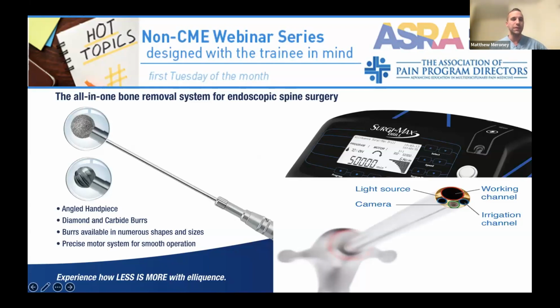So just kind of basically, if you look here to the left, there are multiple types of drills, which you don't generally have to use for rhizotomy, but we'll get into where you do. So there's a diamond encrusted drill. There's a carbide drill. The reason that matters is you can use that to target different things.